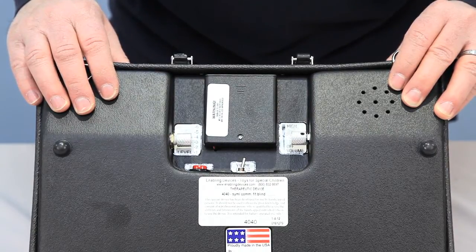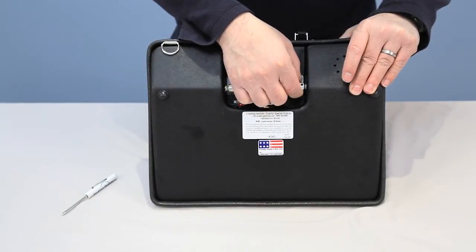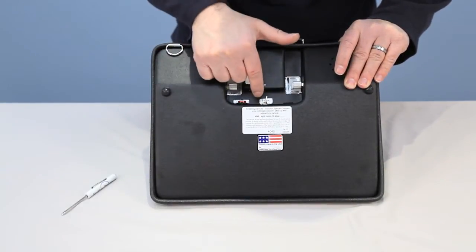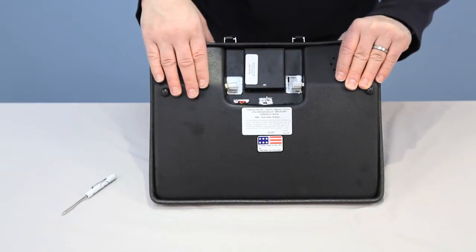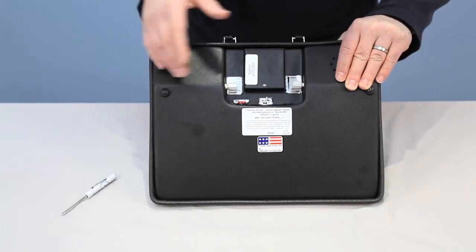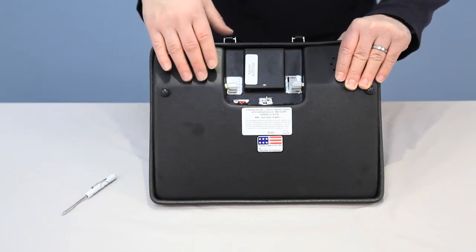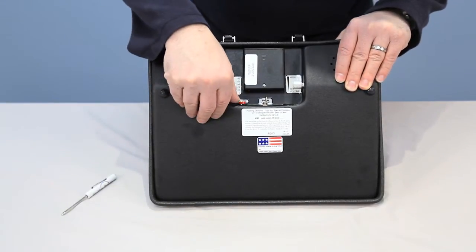Now I want to show you how simple it is to record a message on the communicator. First, turn the unit on and turn the volume up. During recording, it's important to have the vibration toggle switch set to off — you don't want any feedback during your recording. Once you've recorded, you can turn it on if you want to use that function.